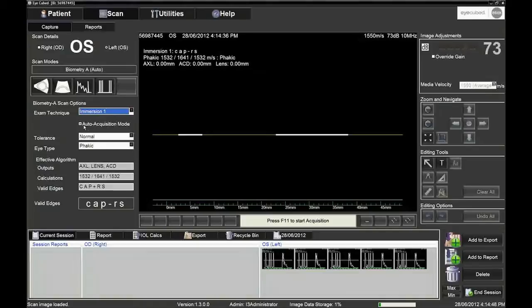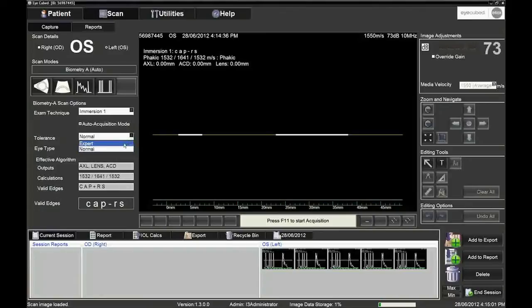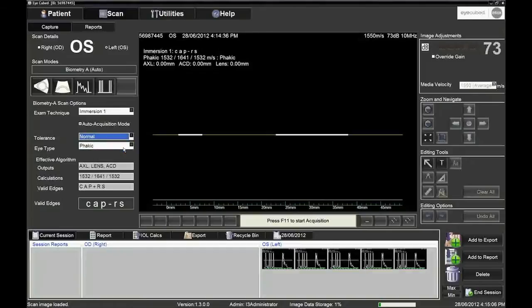In manual freeze mode, the operator decides which images to freeze. In auto acquisition mode, the system will automatically freeze up to five images that it recognizes as corresponding to the correct echo pattern. Choose normal mode and only revert to expert mode if it is impossible to obtain a correct reading in normal mode.